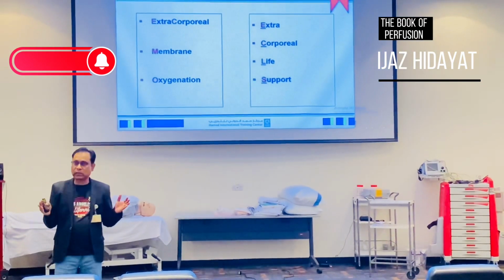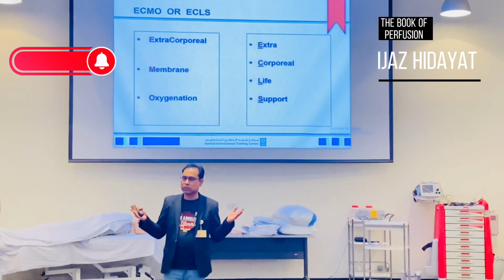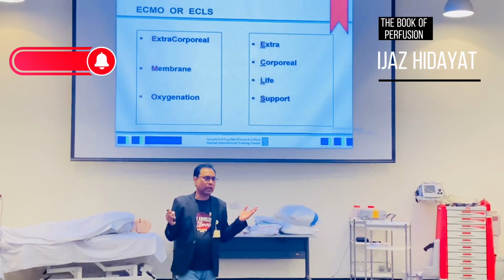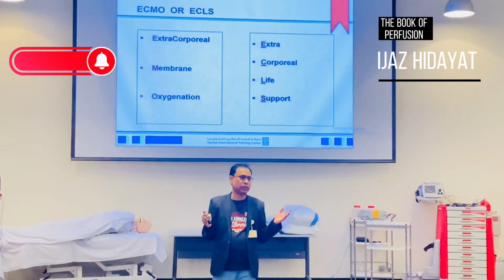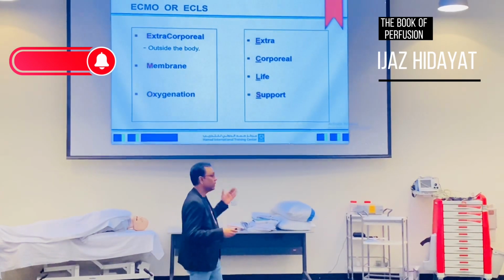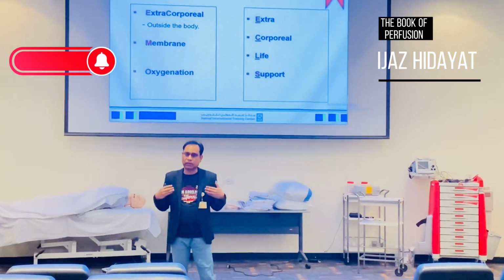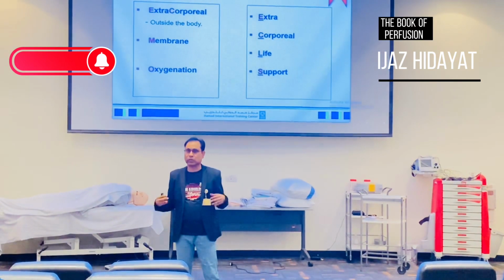So, what does ECMO stand for? Extracorporeal membrane oxygenation. Extracorporeal means outside the body. When you talk about oxygenation, it's inside the body. You work with the patient's human body.